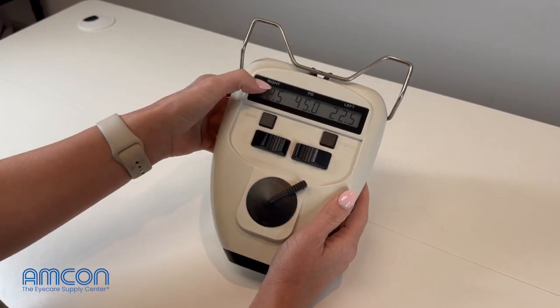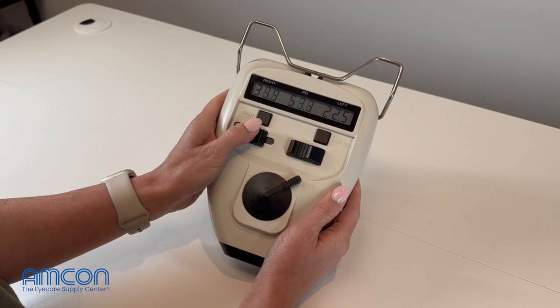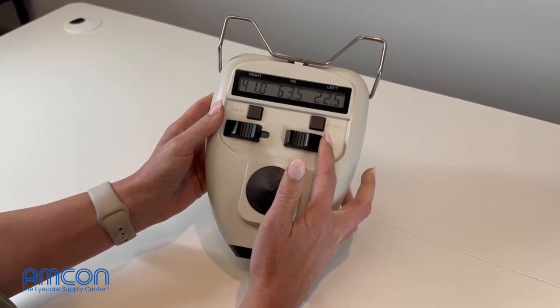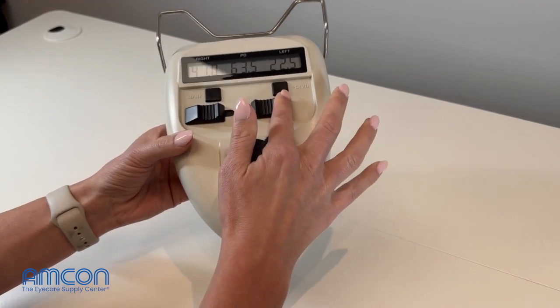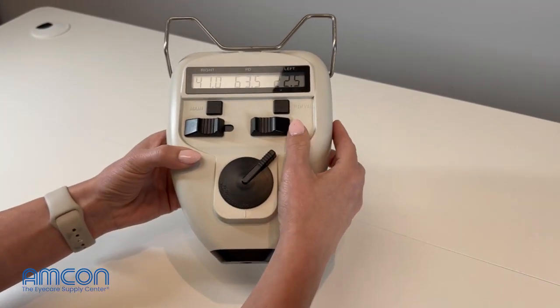Take your right measure side and push it all the way towards the temple. Take your left measure side and push it all the way towards the nasal part of the pupilometer. Imagining the patient's head is here, you want to make sure both of these are pushed to your left — the patient's right.